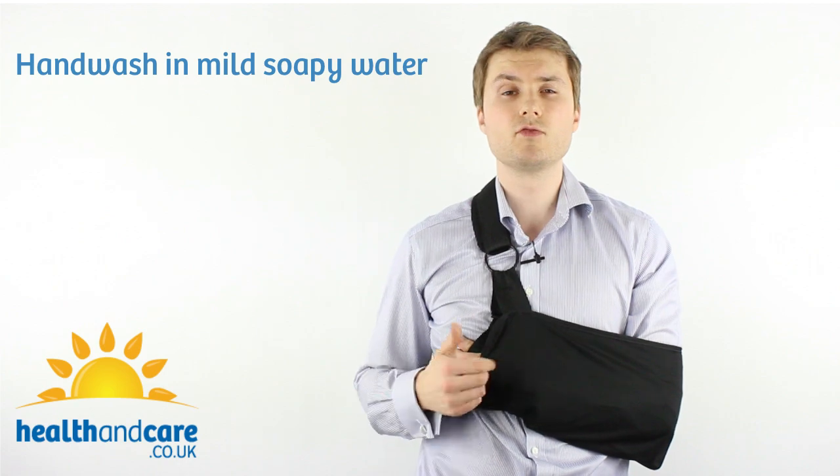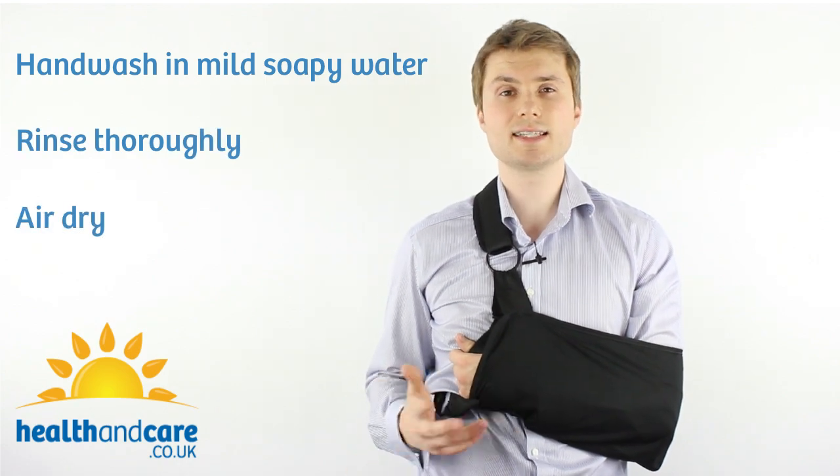Washing the ProCare Clinical Shoulder Immobiliser couldn't be easier. Simply hand wash in mild soapy water, rinse thoroughly and air dry. It's as simple as that.